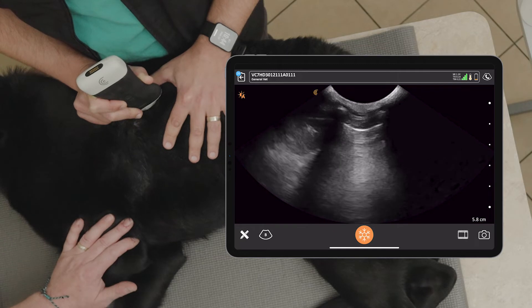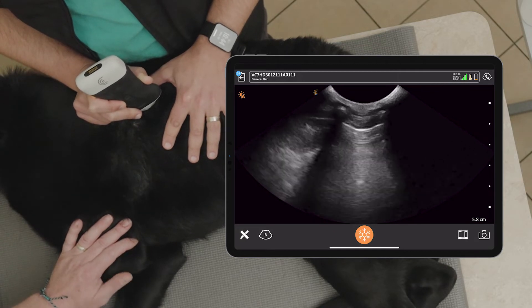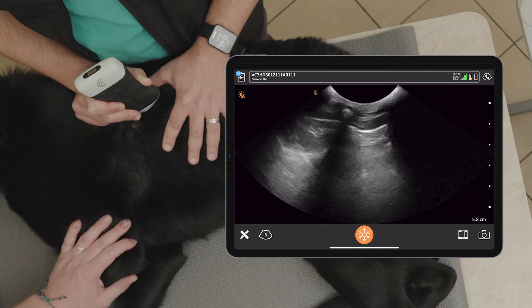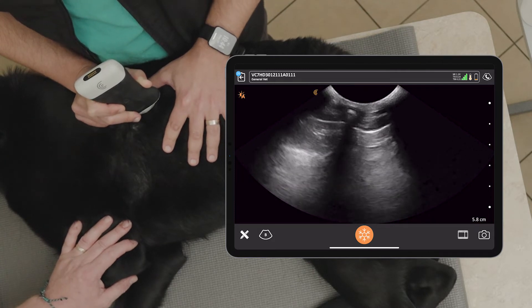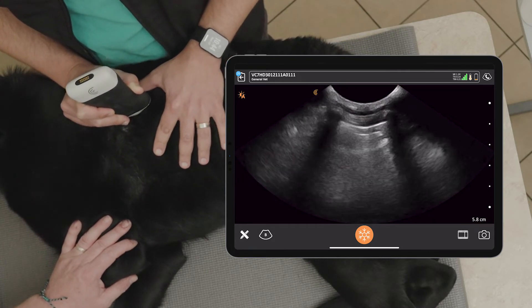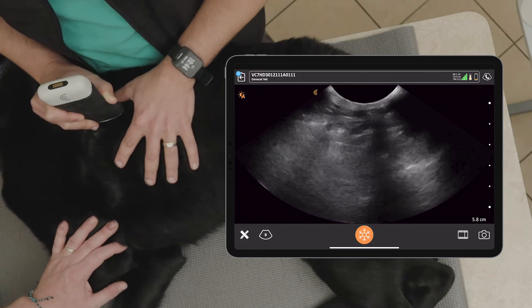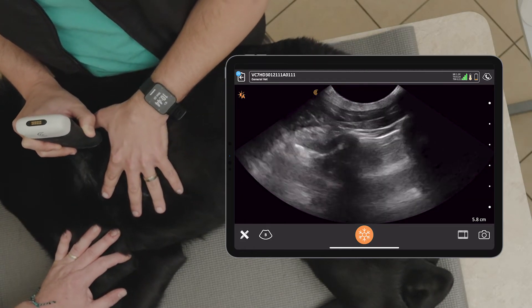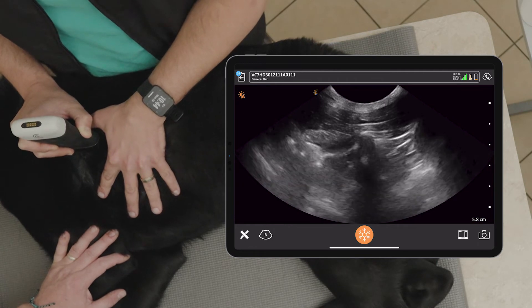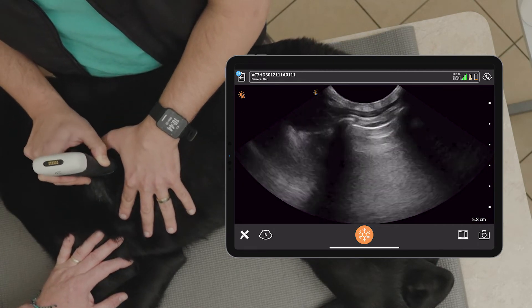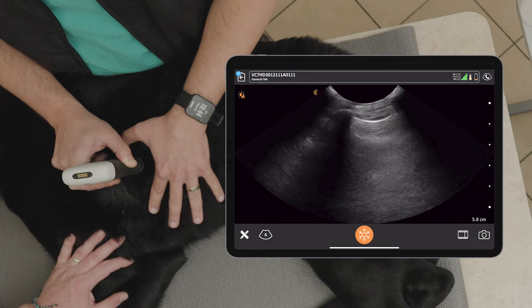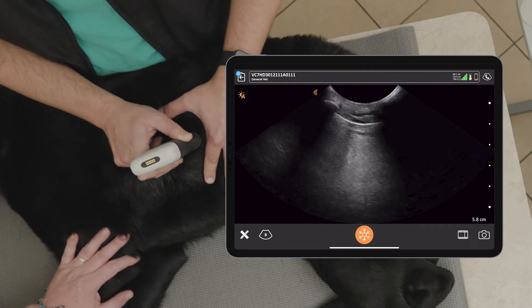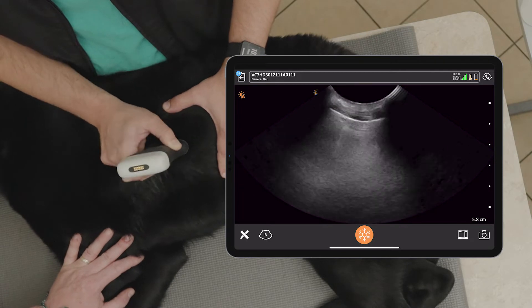Once we found that caudal dorsal side, if we see lung sliding there, we know the lung is in contact with the chest wall and we can now scan the lung surface. We're going to scan the dorsal third by simply sliding cranially until we can't go any further, looking for B lines or consolidation coming off that pleural line. We don't see any there. We come back down to mid thorax — no pathology. We come caudal again until we hit that vertical edge artifact, the curtain sign — no B lines, no pathology noted there.